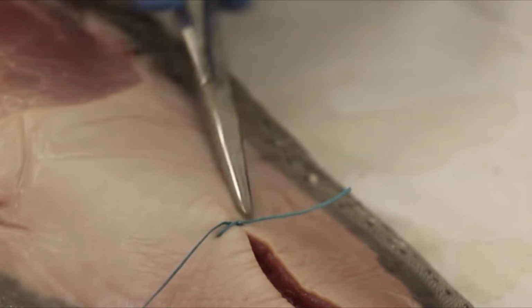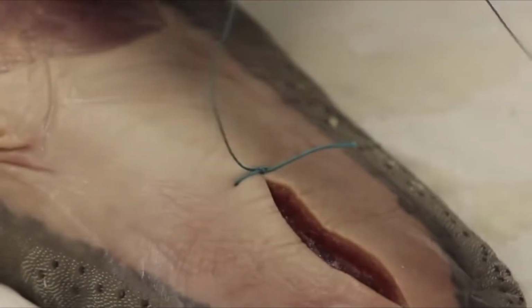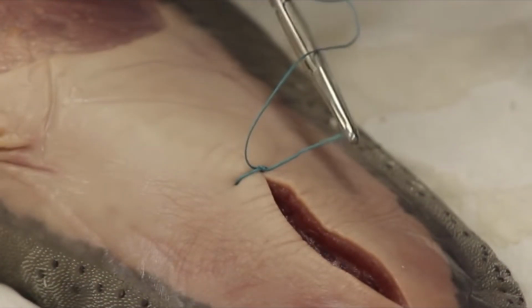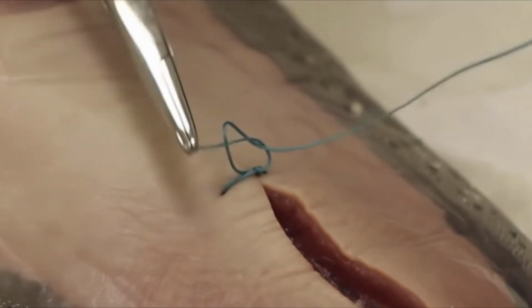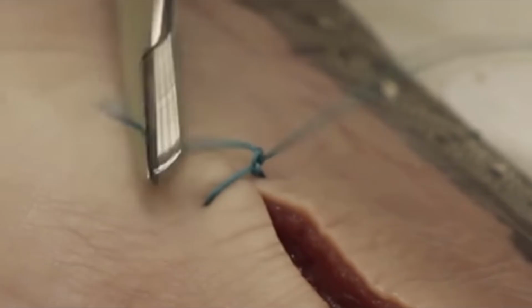Because it slides, the knot can be tightened too far. The advantage is that it can also be loosened. The knot is adjusted back and forth until the edges are approximated, with no blanching, and the tension looks correct. Once the edge position is exactly where it should be, the slip knot is converted into a square knot so it does not keep sliding. To convert it, place the driver between the strands again, wrap once, and seat the throw flat.